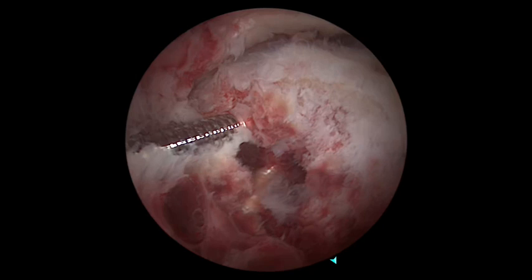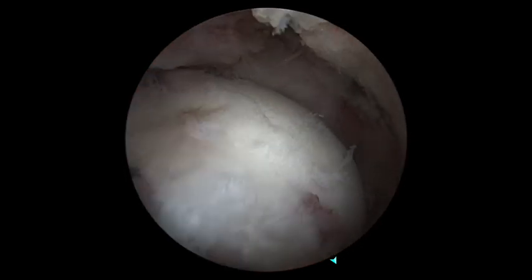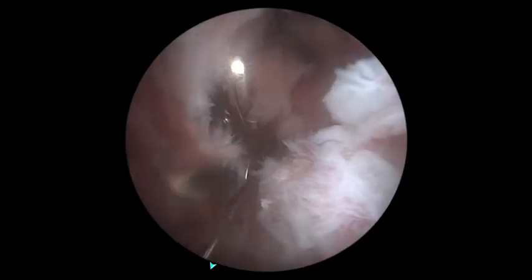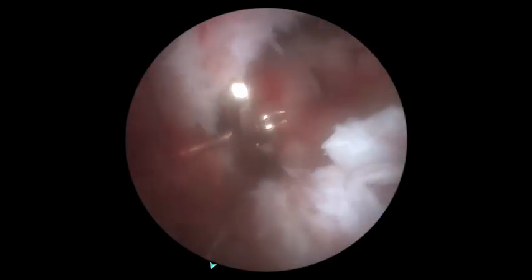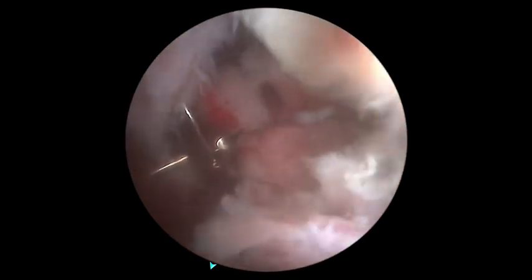Not shown in this video, we did place a double-loaded suture anchor anteriorly and pass this through the rotator cuff in horizontal mattress fashion. As you can see, there was a large bony defect which did not allow us to place any additional anchors due to poor purchase in the bone. We therefore elected to utilize the proximal humerus plate with holes that are made for suture fixation.